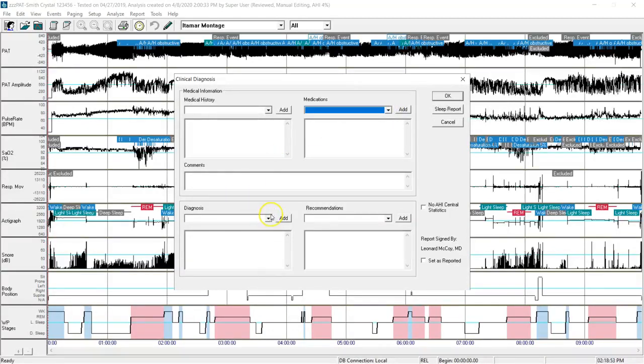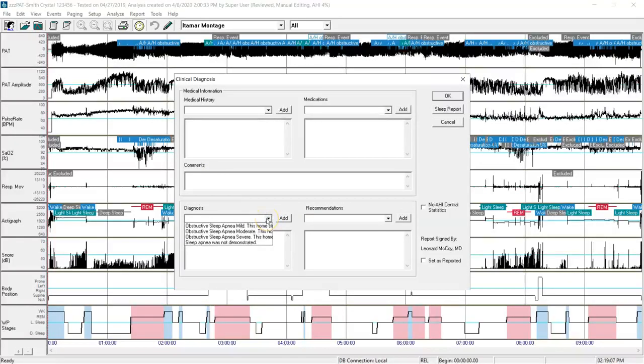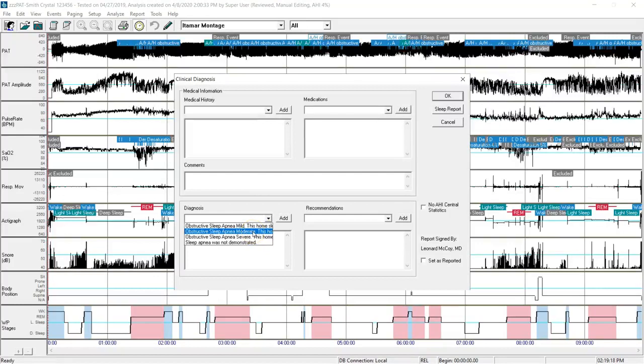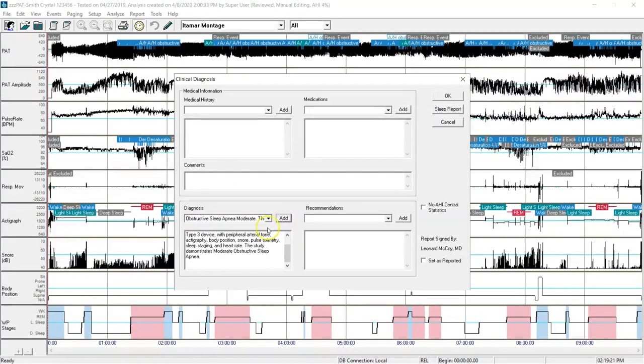In this case, I'm going to go right to diagnosis and recommendation. I click on my down arrow, and I'll see that there are opportunities to select mild, moderate, or severe. In this case, I'll pick moderate for her since her AHI was 16.1, and click add.